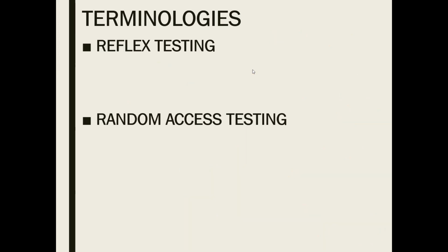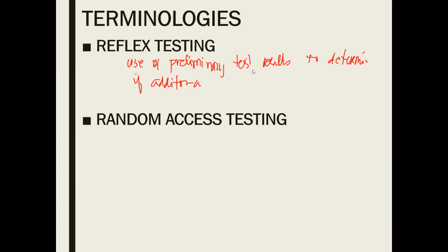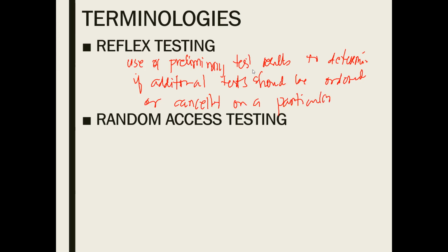When we said reflex testing, use of preliminary test results to determine if additional tests should be ordered or canceled on a particular specimen.